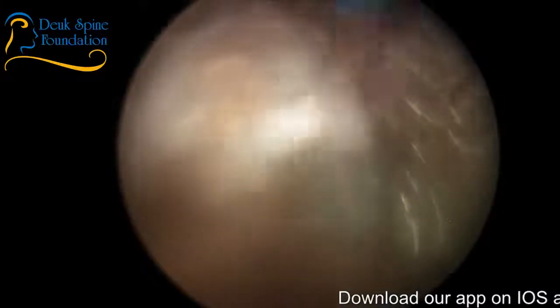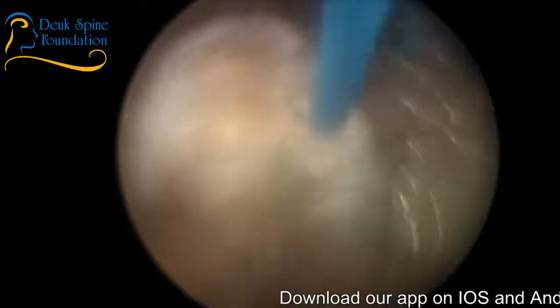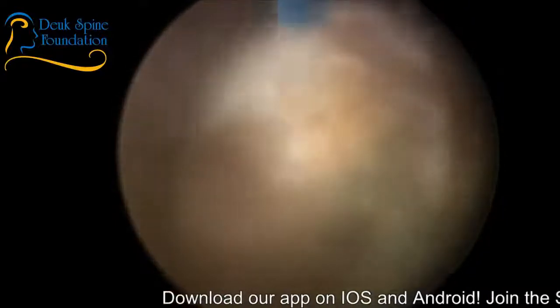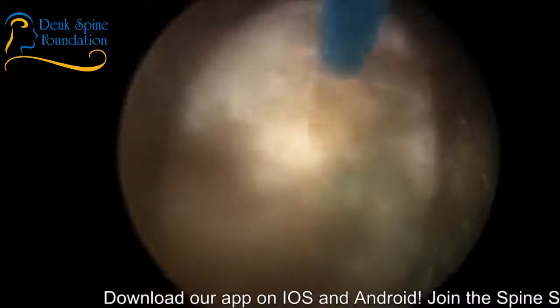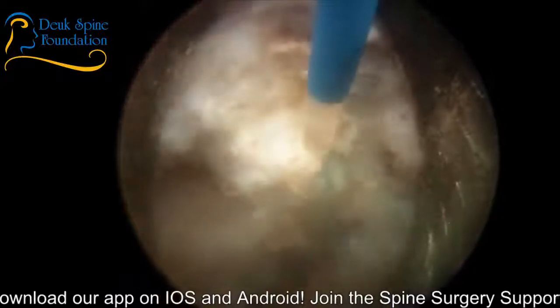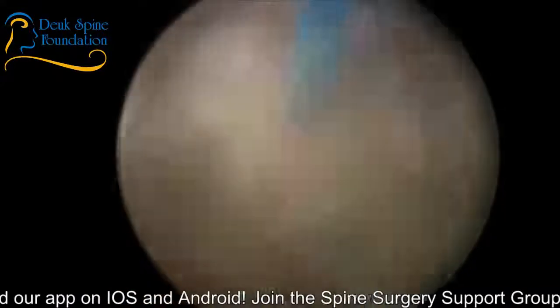And it basically creates a burst of energy that's transmitted along this fiber all the way down into the disc where I direct it. That's a bone spur right there. That's weird. Did we just change suction?